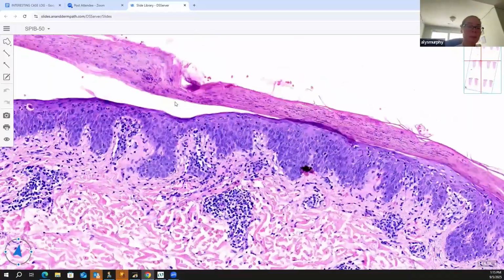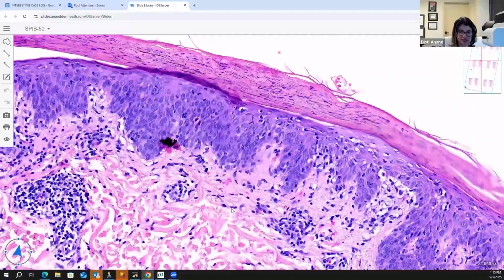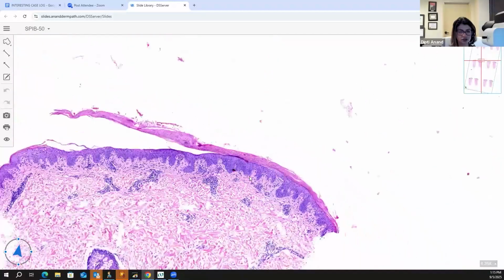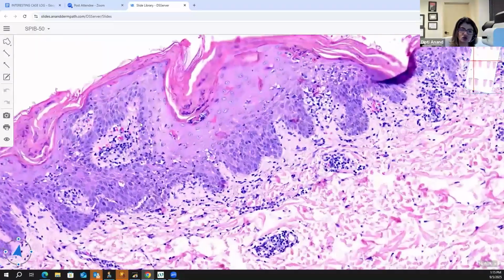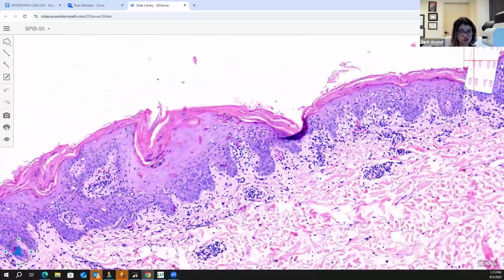This pattern of parakeratotic crust with the lymphocytes in the epi and the vacuolar change, and you can see some extravasated blood, is classic for Pityriasis lichenoides. Do you get that? And you see here, there's so many necrotics in here, actually. You see this? MF will not do that.